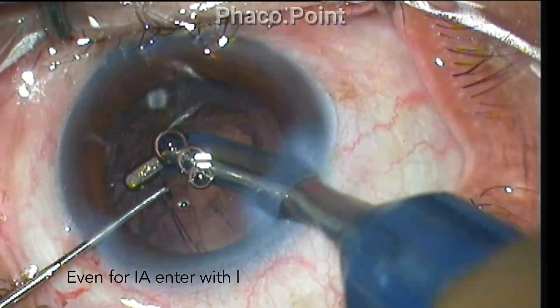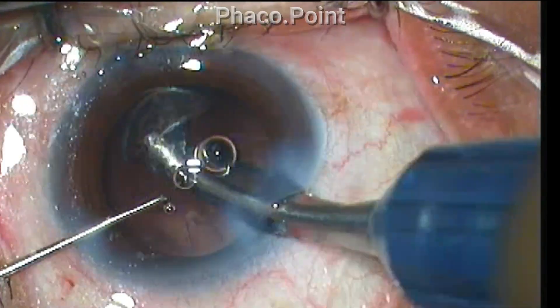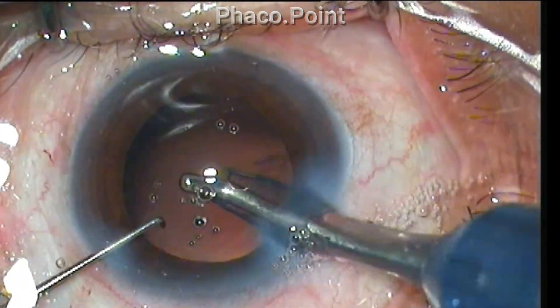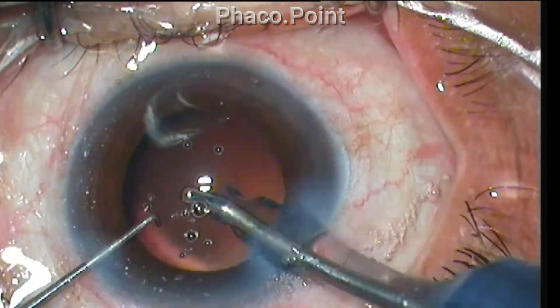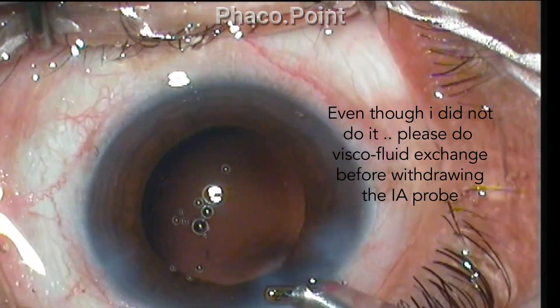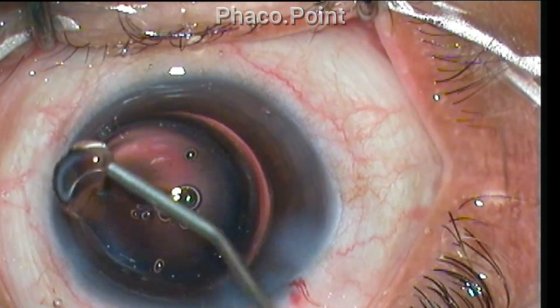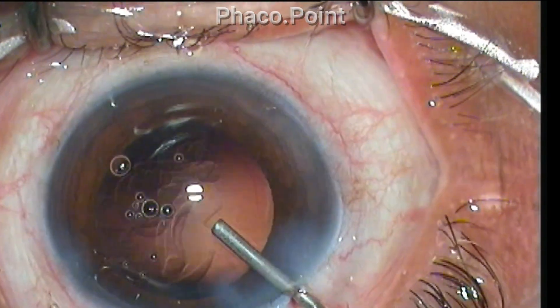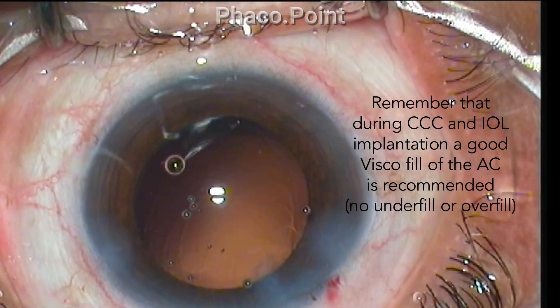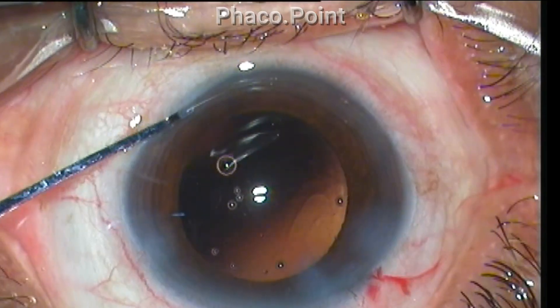Low bottle height parameters should be maintained even for entry of the coaxial I/A probe into the eye. In this case I did not perform a viscoelastic-BSS exchange, but I recommend you perform it every time you remove either the phaco probe or the I/A cannula from the eye. There are two situations where viscoelastic should completely fill the anterior chamber: during the CCC and during intraocular lens implantation.